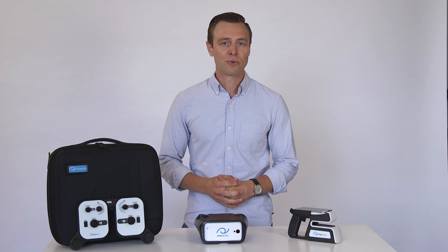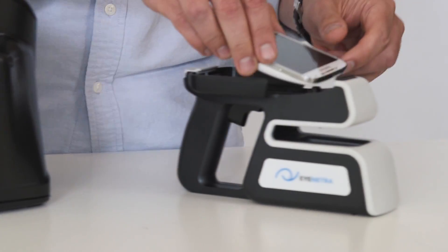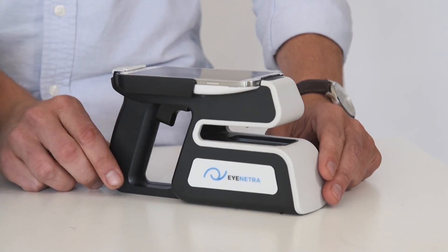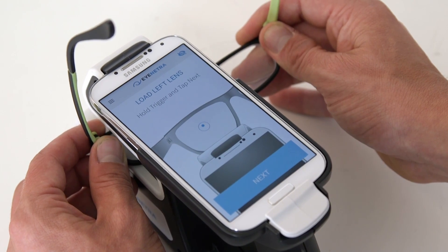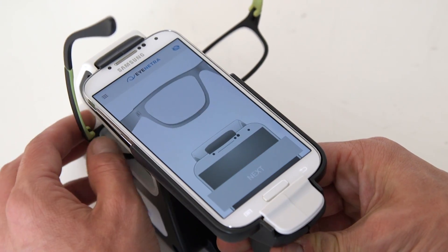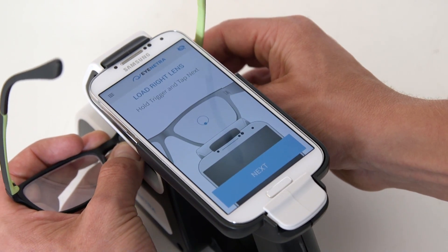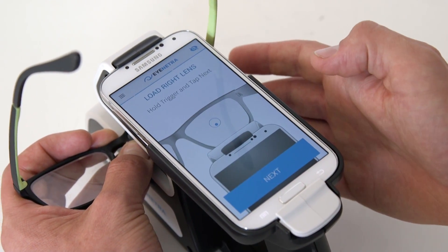After conducting the initial refractive assessment, we can remove the phone from the autorefractor and clip it right into the Netrometer. The Netrometer measures single-vision, bifocal, and progressive eyeglasses. Its user-friendly design requires minimal training and captures measurements in seconds. Simply enter the glasses, center the dot within the target, and tap the screen to take a reading.